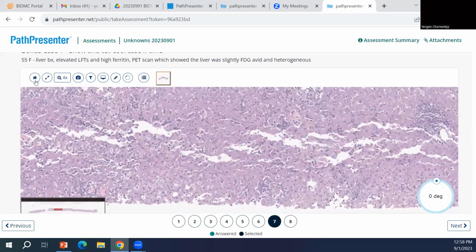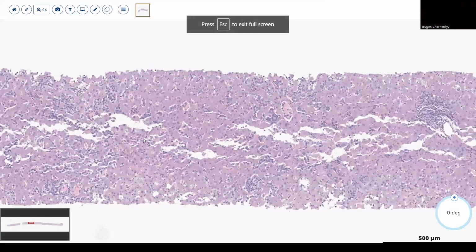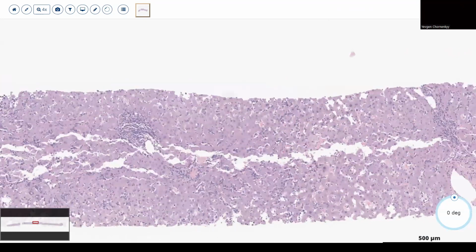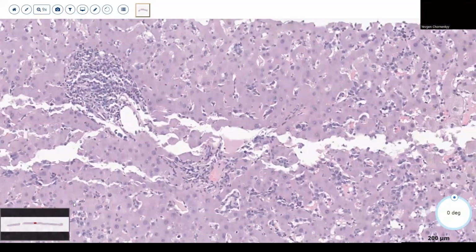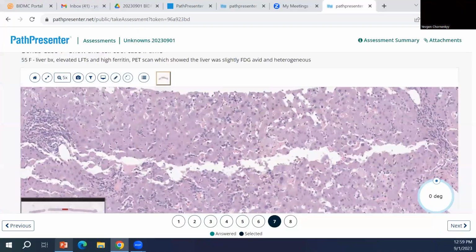It does bring up the differential. What other than heme can go down the sinusoids like that? I mean, angiosarcomas can do that. Epithelioid hemangioendothelioma can occasionally do that. I've seen metastatic carcinomas traveling up and down the sinusoids like that. Just trying to think of anything else, but heme things are most likely to spread in that sinusoidal pattern. Yeah, this was very unexpected.